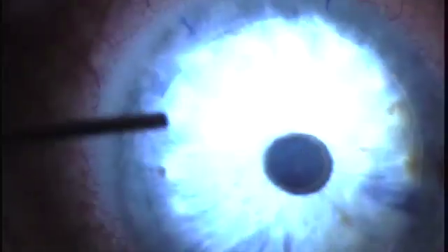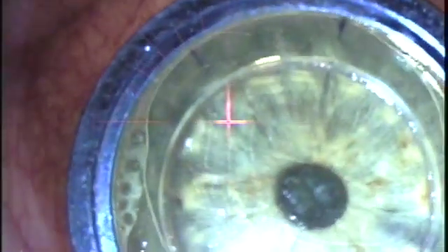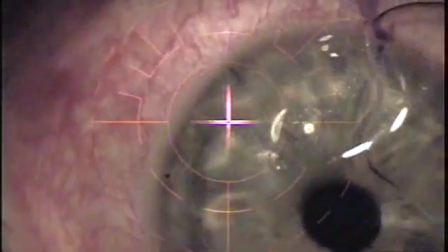under the flap, and once that's been observed to be clean, a Johnson applanator will be brought into the field to further squeegee out any fluid, and a contact lens placed on the eye. The contact will be left there for several days and then removed. With this technique, the ingrowth rate has been less than 1%.